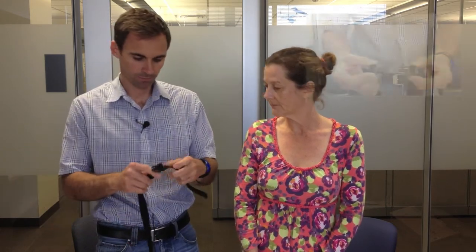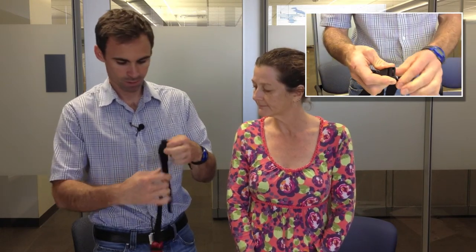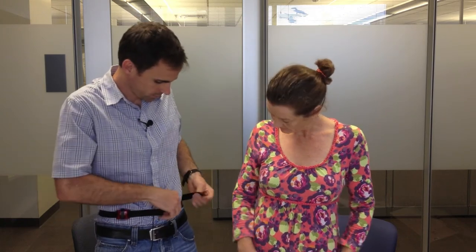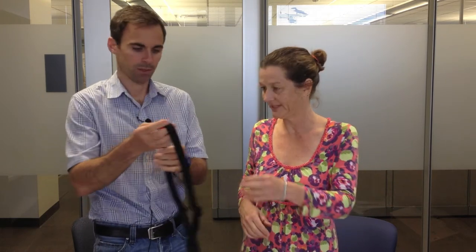The belt is adjustable, so you'll just pull it through the clasp to make it shorter or longer, whichever you need. And again, this button goes up just above the right hip, and then click it to yourself. You can tuck any remaining straps up — just please don't cut them or anything like that. So let me give it to you and you can demonstrate, and then you'll be all set.